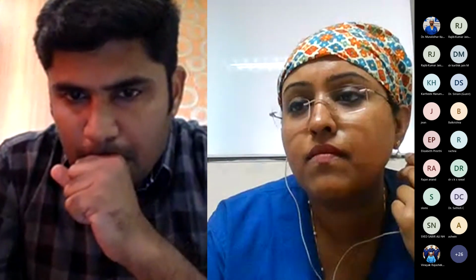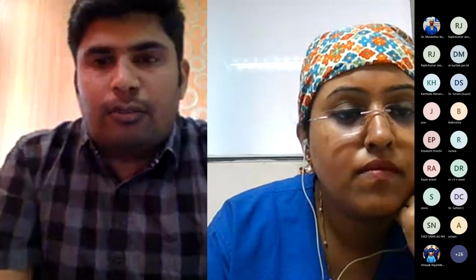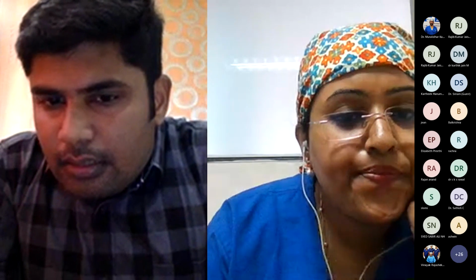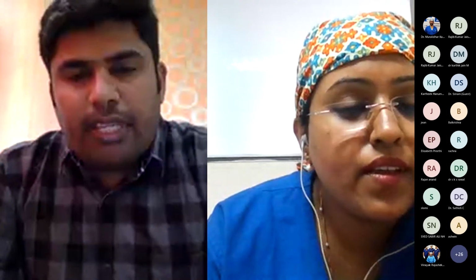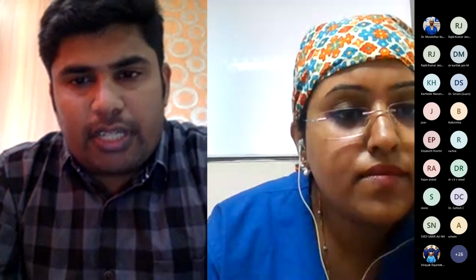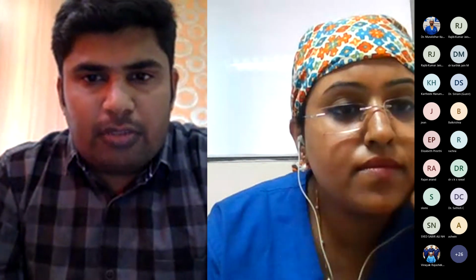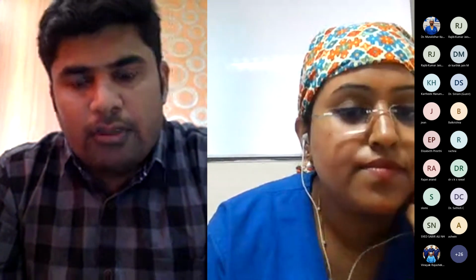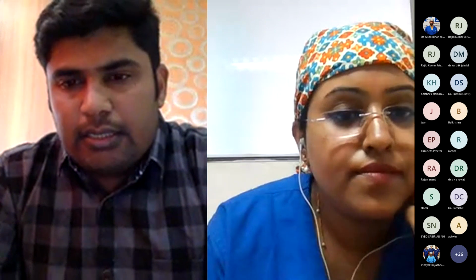There's one question in the chat box about what is the best view to get the pulmonary acceleration time. The ascending aortic short axis view is a better view, or the upper esophageal aortic short axis view can also be used for the main pulmonary artery.